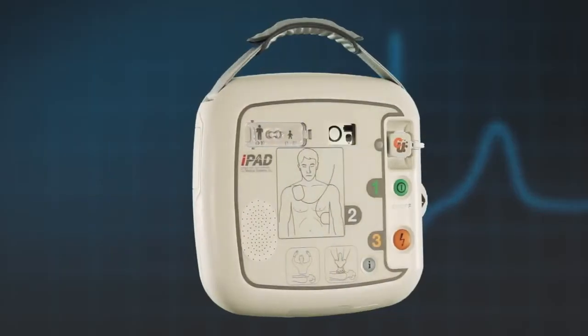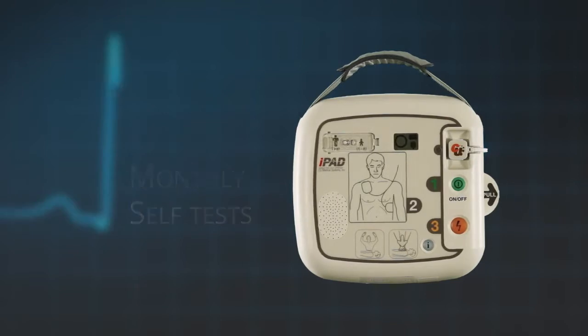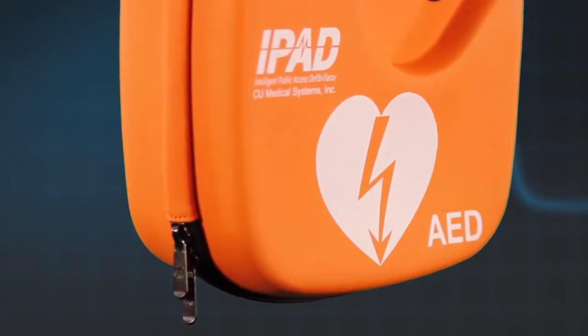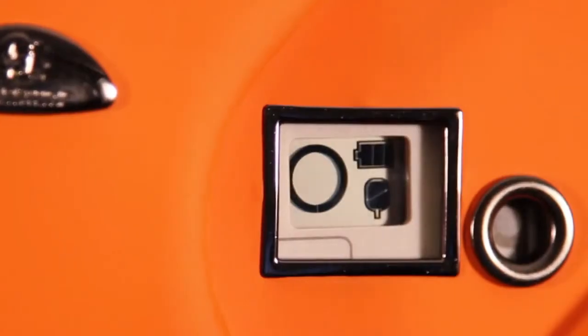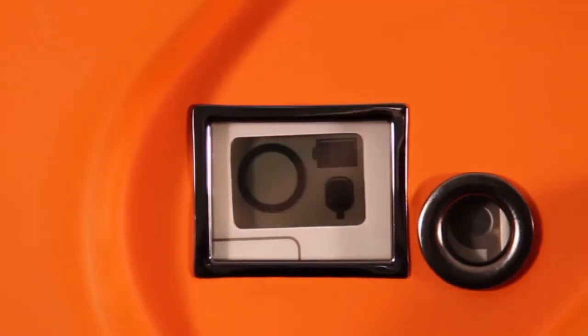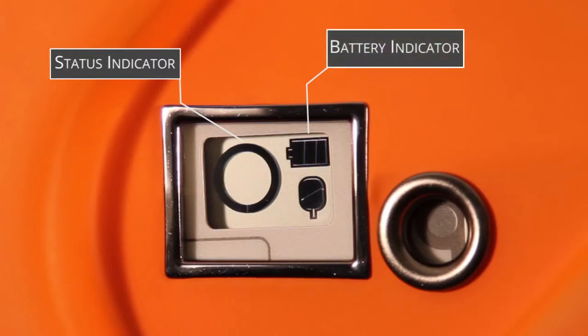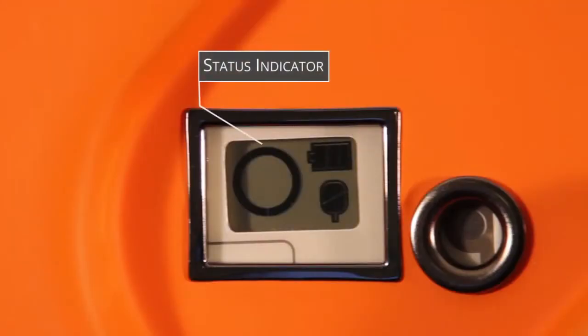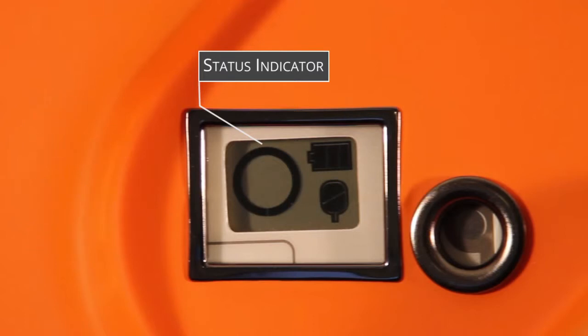The iPad SP1 AED performs a daily, weekly, and monthly self-test. However, it is still important to visually check your AED on a regular basis. This is done simply by looking at the unit status window, which is visible through the carrying case. This window shows three key things: one, a status indicator; two, a battery indicator; three, a pads indicator. The status indicator will indicate if the iPad SP1 is working correctly by carrying out daily, weekly, and monthly self-tests. If all tests are passed successfully, the indicator will show a circle.